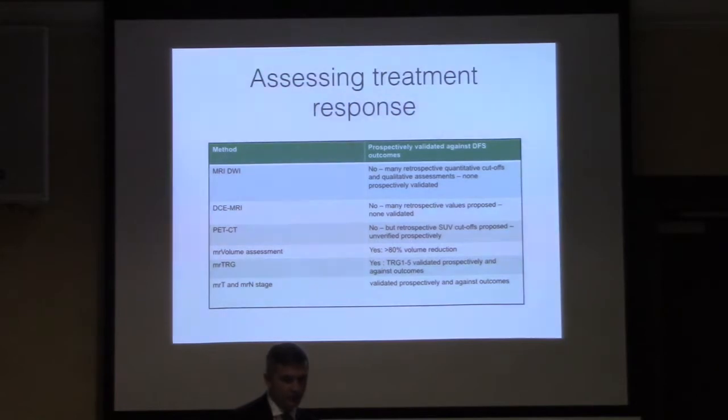What about dynamic contrast imaging? So that's really a question to somebody who said to use contrast. Well, that's also unreliable. There are some retrospective studies which say it's okay, but they haven't been properly validated. So at the moment, it probably doesn't have a role. What about PET scanning? Well, yes or no, because the problem is that we're looking at very small foci of disease, and so we can't confidently, with the standard uptake value that we use, say this is tumour, not inflammation, there's an overlap. So again, that's not particularly reliable either.